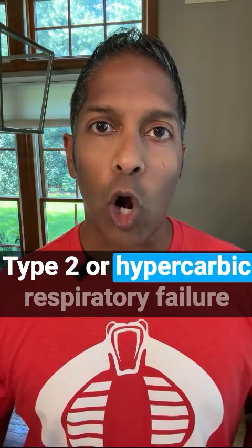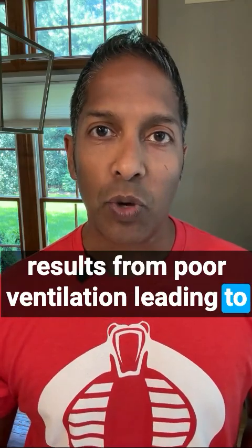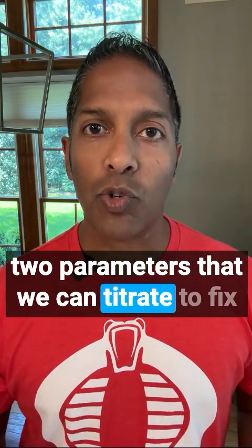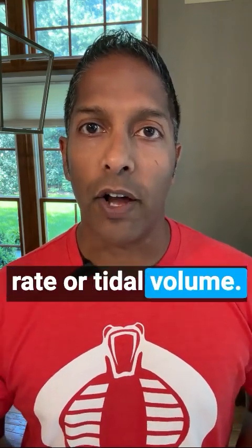Type 2 or hypercarbic respiratory failure results from poor ventilation leading to CO2 accumulation. We can fix that either with invasive or non-invasive ventilation, and the two parameters that we can titrate to fix that ventilatory issue are either respiratory rate or tidal volume.